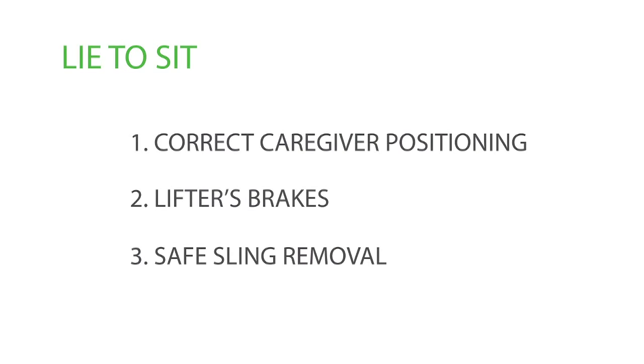Remember these steps and our three focus points: correct caregiver positioning, lifter brakes, and safe sling removal for safe resident handling in lie-to-sit transfers.